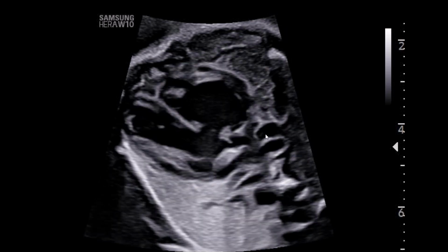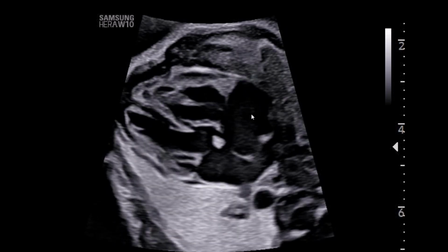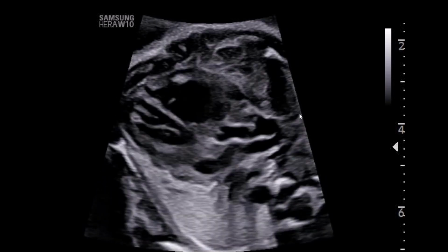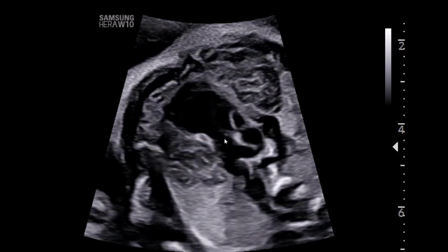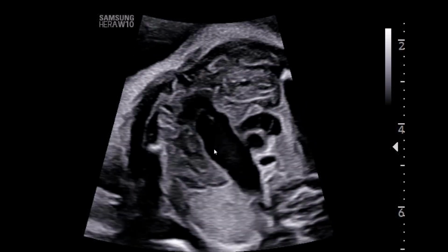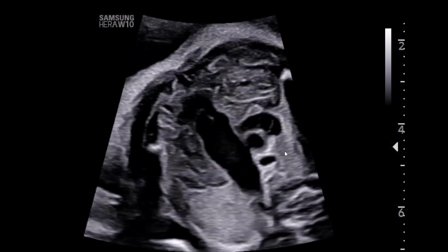And as we look at the right heart connections, you can see that the right atrium connects normally to the right ventricle. And so as we transition to the right ventricular outflow tract, that right ventricle then connects to this morphologic pulmonary artery. And so that is a concordant connection as well. And so we have normal cardiac connections.